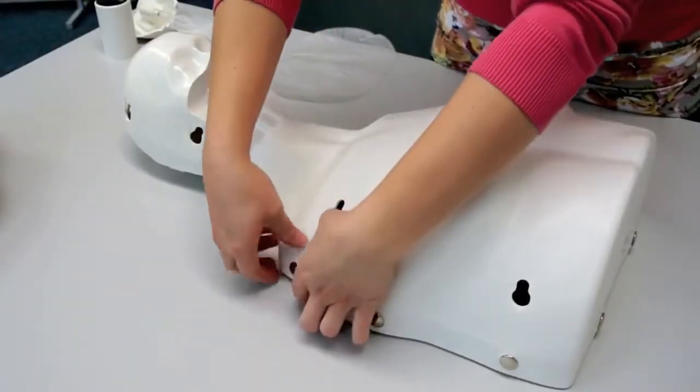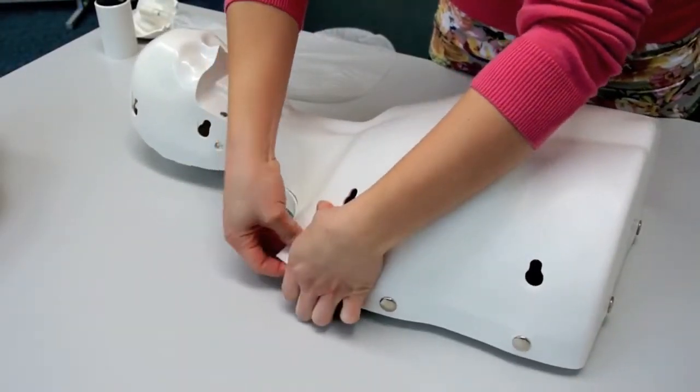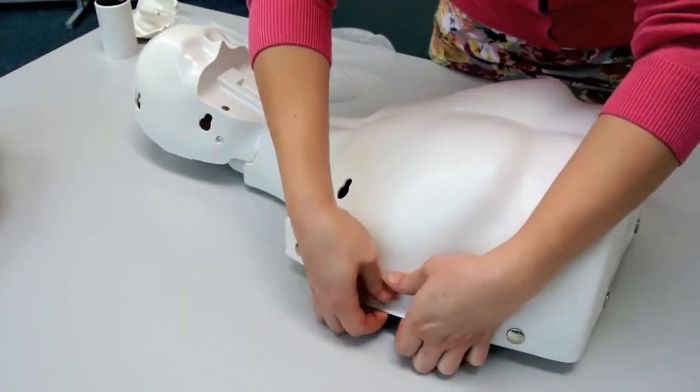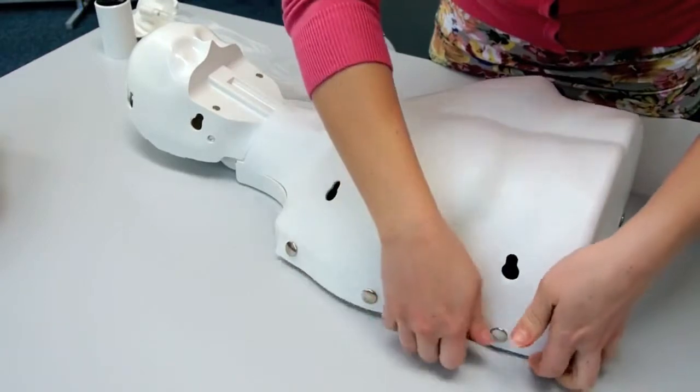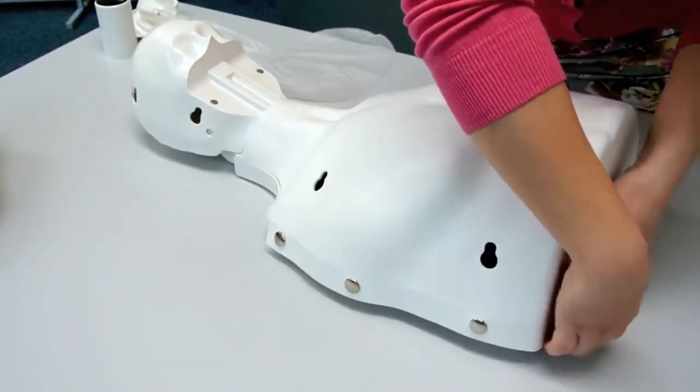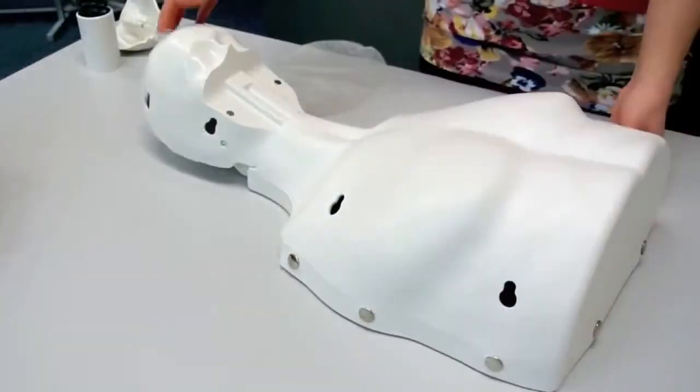Changing the compression spring allows for child mode. Once the thorax skin, face skin, and lung bag have been removed, the thorax cover can be detached and removed.